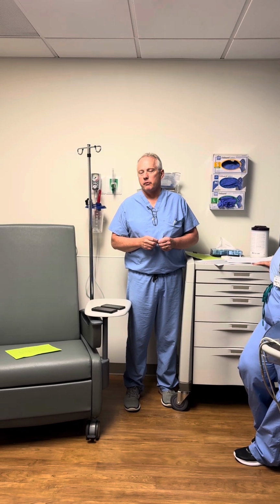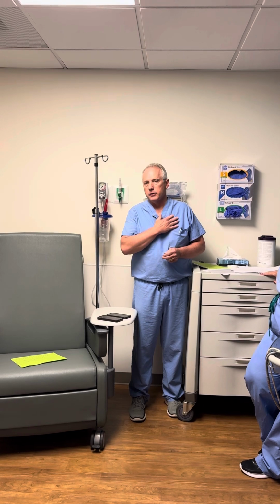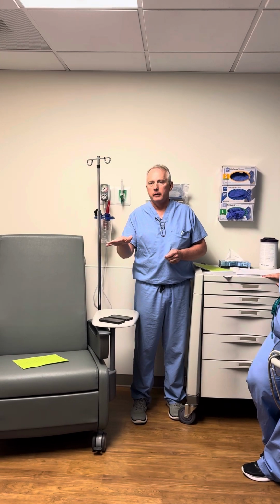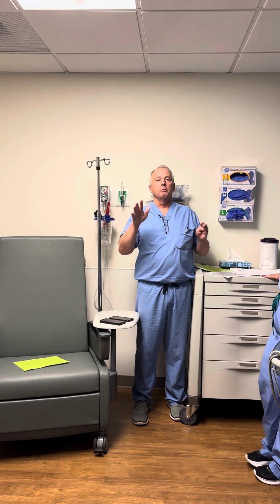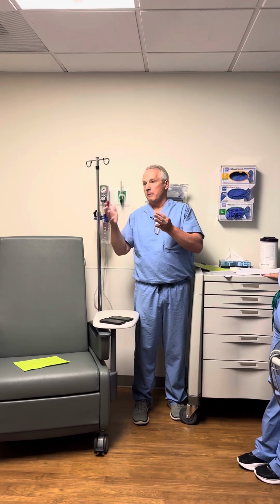But it's just rare to see a bad outcome, right? And if you're in doubt, put the magnet on there. All the magnet does is close that reed switch so that it goes blind. Some patients may be a little symptomatic with that type of pacing, because it's going to go blind and pace at a rate of like 90 or 80 or 100, depending on the manufacturer.